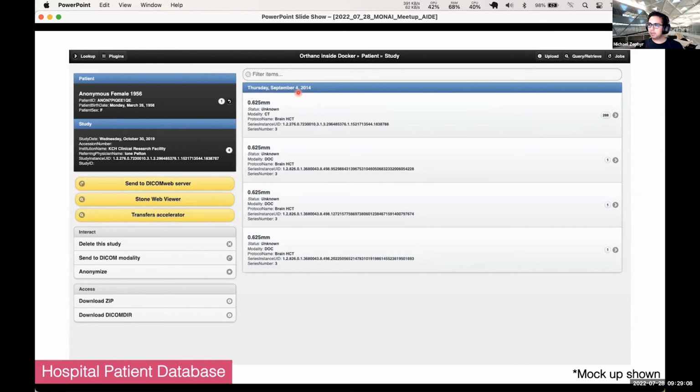Okay. We have another one here. While PACS are supported, are imaging databases like XNAT supported? Yes. So this is all designed to be open source as well. So again, the AIDE platform, I'm just using PACS as a demonstrator of one for the hospital scenario, basically. So that's very commonly used across hospitals. But if you have an XNAT system, and in fact we do have one, whether it's hooked up to our AIDE system yet, I'm not entirely sure, but you will be able to send DICOMs from XNAT to AIDE and then receive them back into an XNAT system.